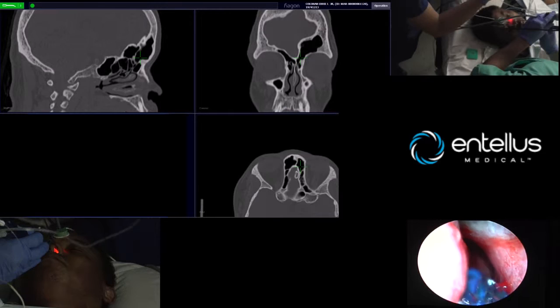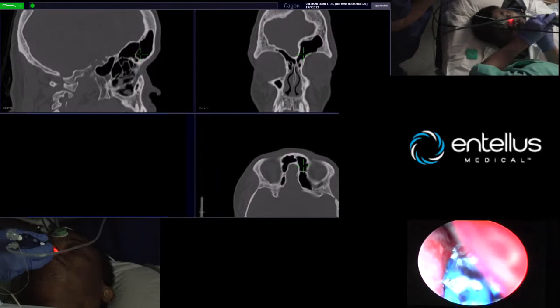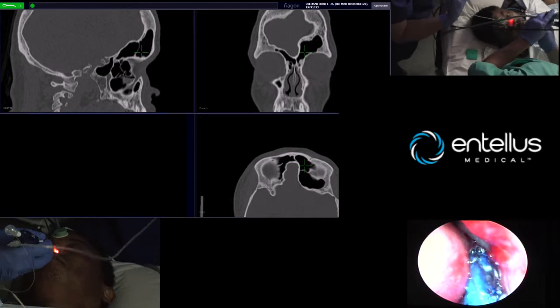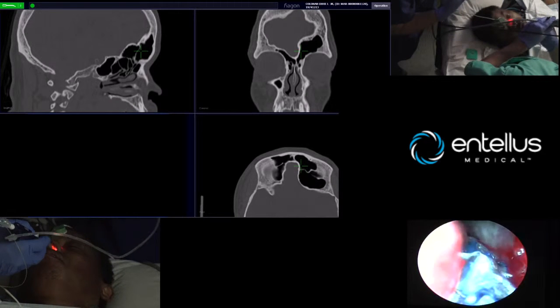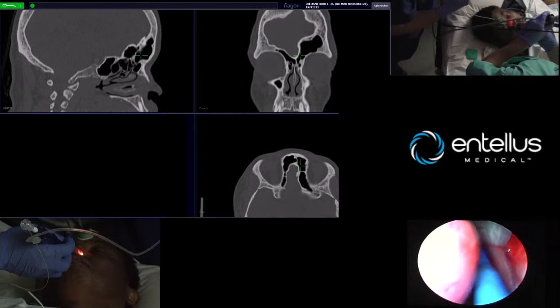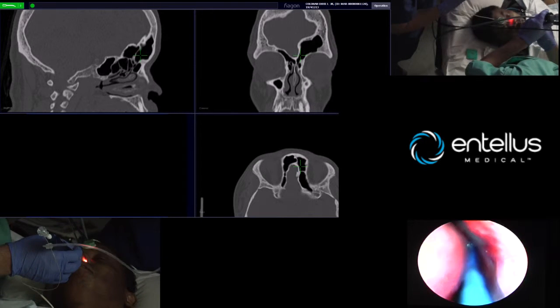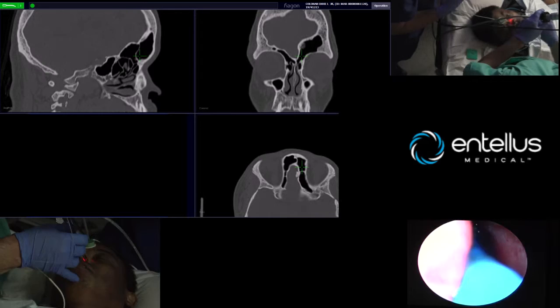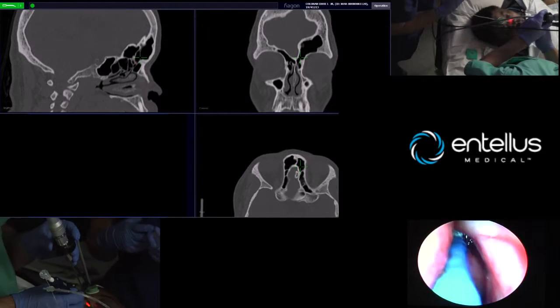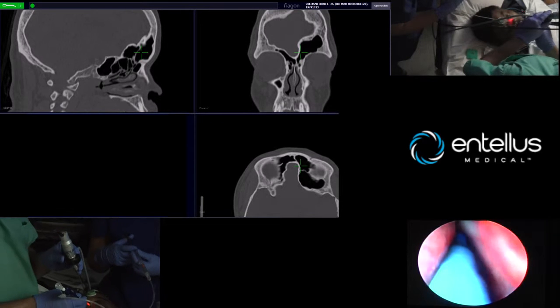You can see, since we've had the dilation, that we're clearly entering and following our marker widely in the frontal sinus. I've been doing balloons now for about four years, and I've always felt very confident that we were doing what we thought we were doing. I do like having image guidance for the safety factor, and I think it's confirming what you knew you were doing.